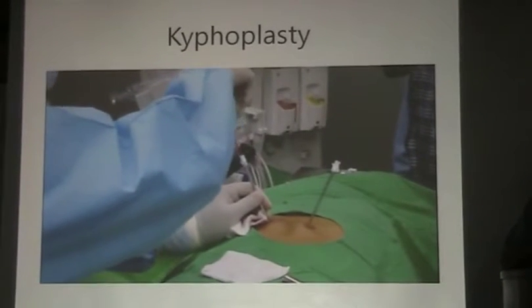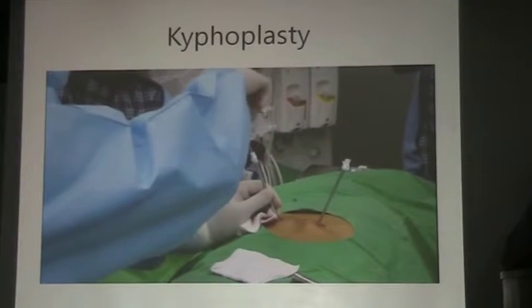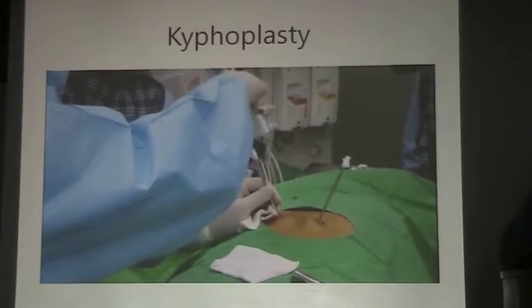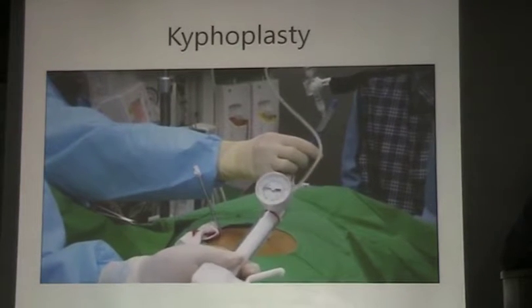Make holes in the vertebral body and fill it with contrast medium.